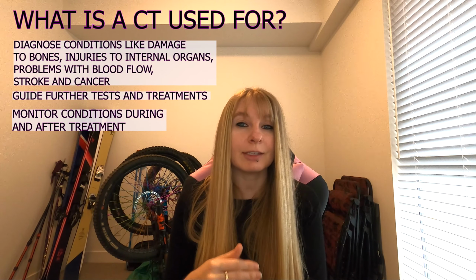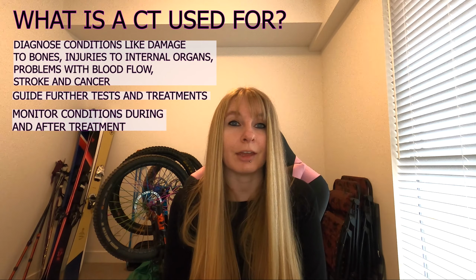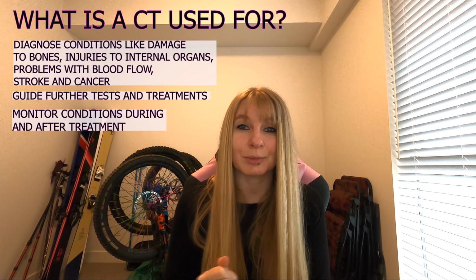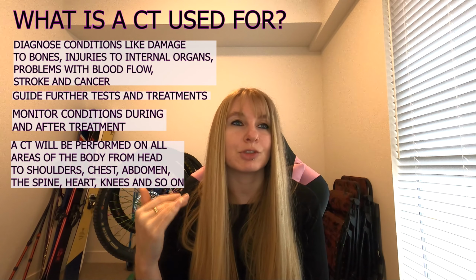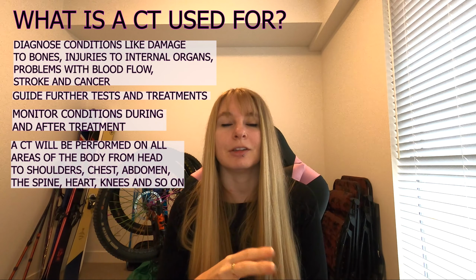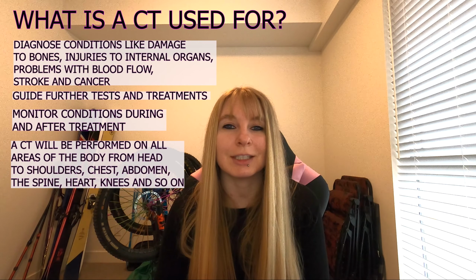So if you think of my case, I had one at diagnosis and then I had one again at the 9-month stage. CTs are performed on all areas of the body from head, shoulders, chest, abdomen, the spine, your heart, your knees, and so on. So what to expect when having one done?